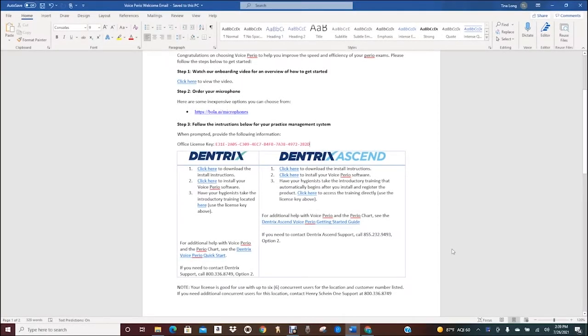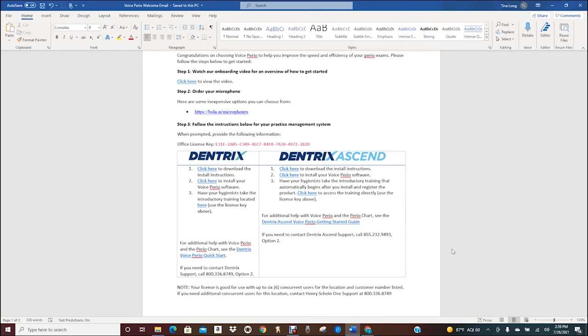Hi and welcome to the Dentrix install to charting video. I'm going to go through all the steps required to order microphones, download VoicePerio, register the software, train the hygiene team, and begin using VoicePerio with patients.